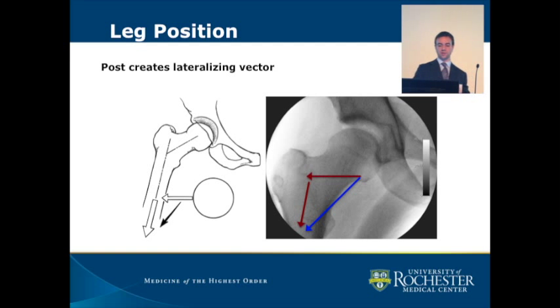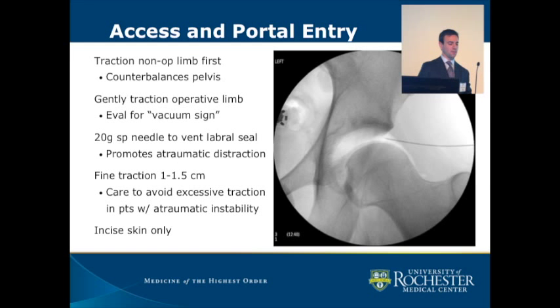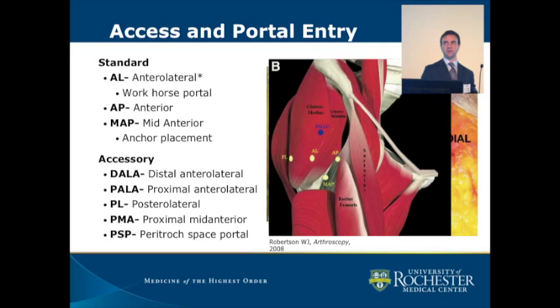The way that I normally start the case is I counter traction the opposite limb to counterbalance the pelvis. I normally apply a bit of fine traction to the operative extremity to make sure that there's no gross distraction, no gross disruption of the capsular integrity or labral seal. And if it stays congruent, before I even drape, I will sterilely introduce a 20-gauge spinal needle to vent the labral seal. You normally will see an air arthrogram, which allows fine, controlled distraction rather than just cranking and cranking until the labral seal breaks open, which is a little bit more traumatic.